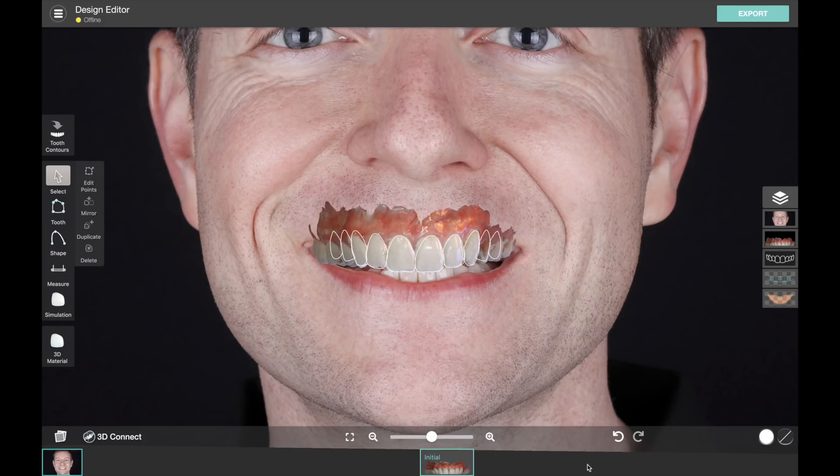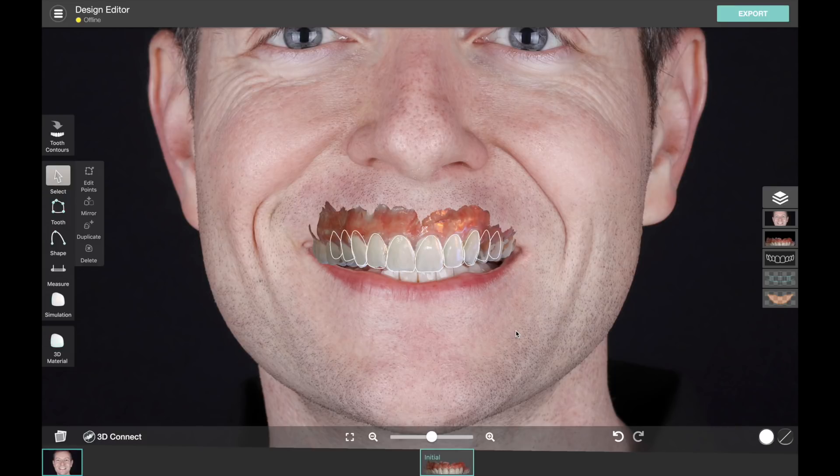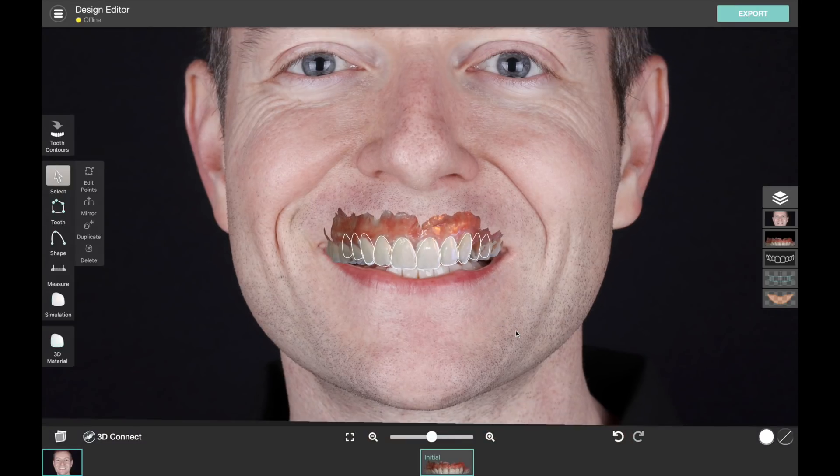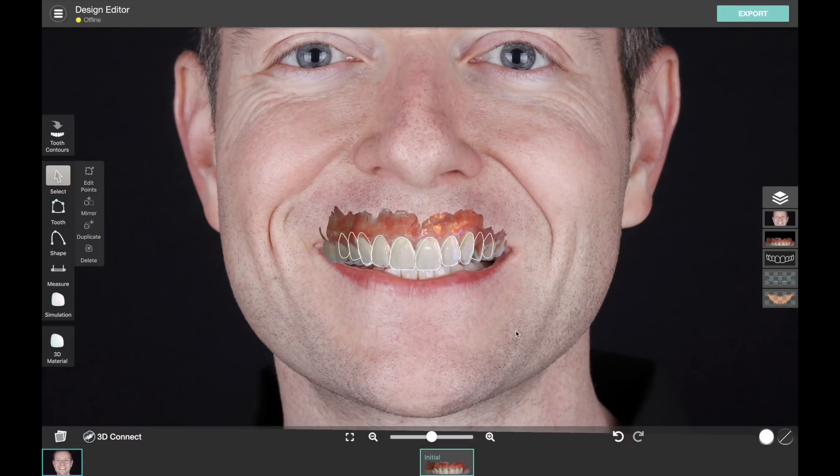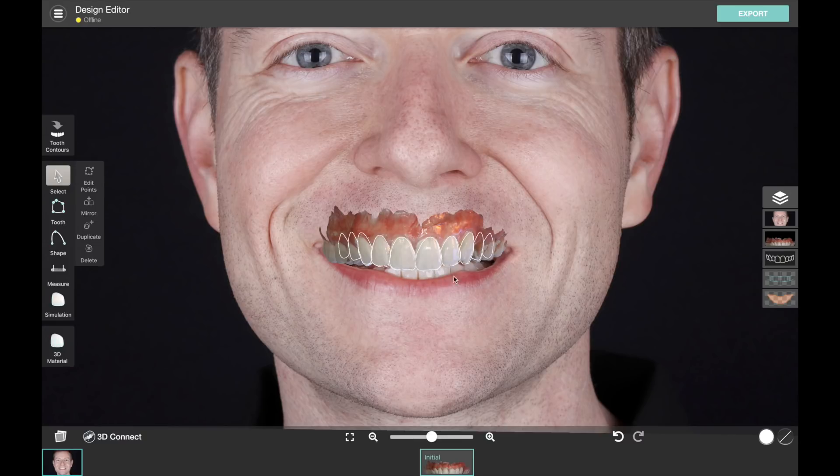And if we scan the final restorations, we can actually bring that back to Smile Designer and see how close did we get to delivering our facially driven treatment plan in the final result. So our initial 3D support is really focused on getting more information in the planning and also doing that quality control step.